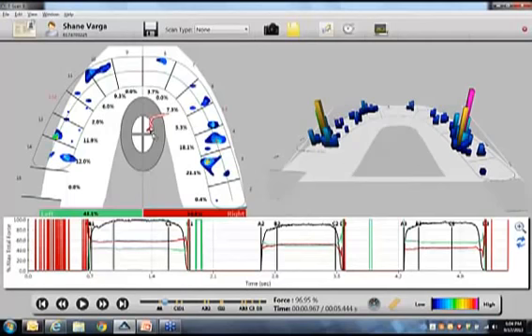And the last thing I want to talk about is this red and white kite, that we call a center of force with a tail behind it. What this shows you is that each point of contact, so right now we're basically at maximum bite in this first bite. You can see where the gray bar is. At each point of contact, it shows you what's the center point based on all the contacts that we see here of that bite, and it shows that my center point is off to the right, kind of in the middle of the overall bite.